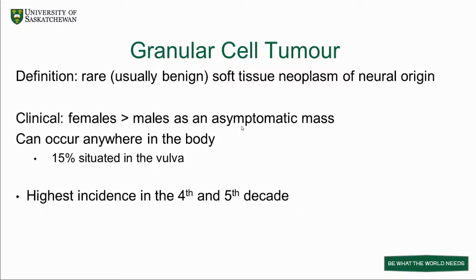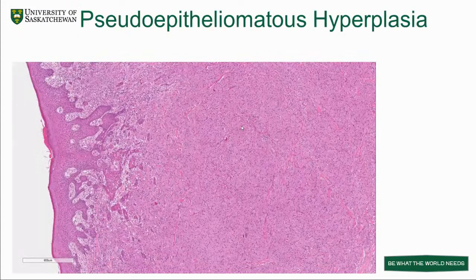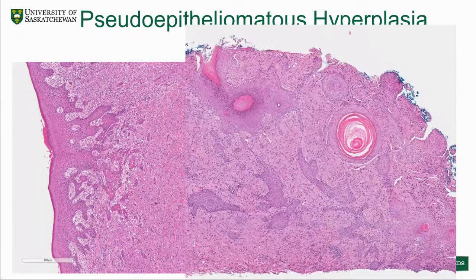Another component that I want to discuss about this particular case is the pseudoepitheliomatous hyperplasia over top. This is also something that can be very distracting, especially if there was an incisional biopsy, like I showed on the IHC, where if you weren't popped onto what was happening in between the squamous layers, you would be going down another path of squamous cell carcinoma. And it was really just this florid reaction, this overlying squamous reaction to the tumor underneath.